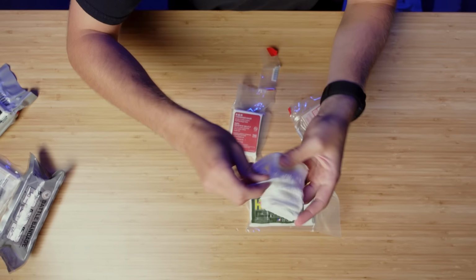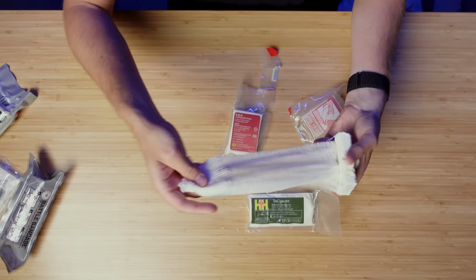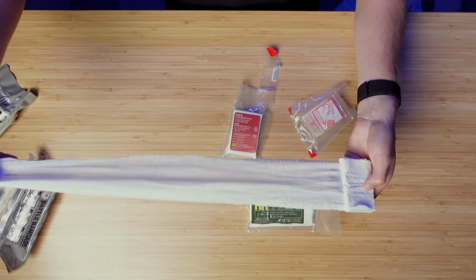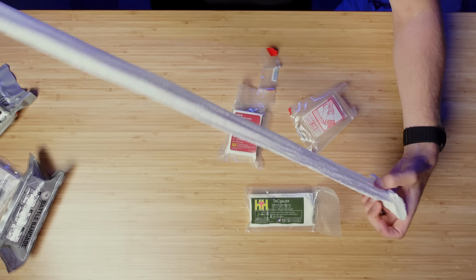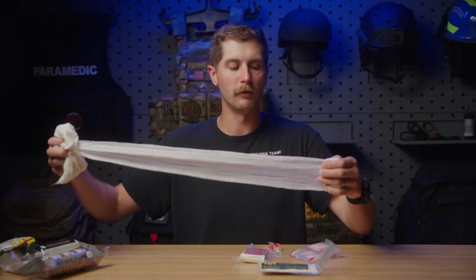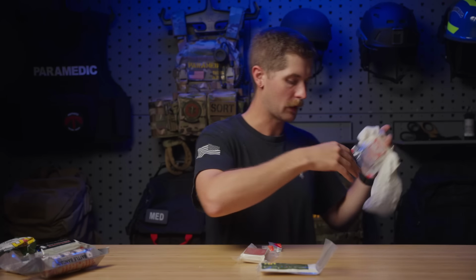This is why I'm doing this video, for reasons just like this. You can kind of pull it off. You notice I never found the end on my own. And now this is not Z-folded. This is just a wrapped gauze. So this turns around, it makes it a little bit less convenient for packing a wound in my experience. And once again, you have quite a lot of it here and it is pretty compact, but it comes out nice and soft, easy to pack a wound with.